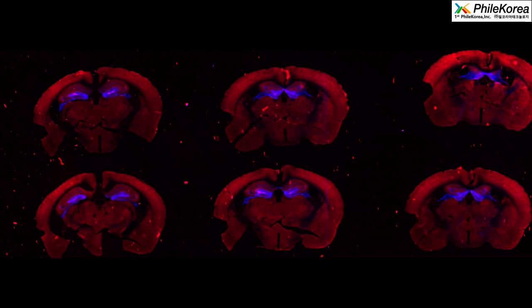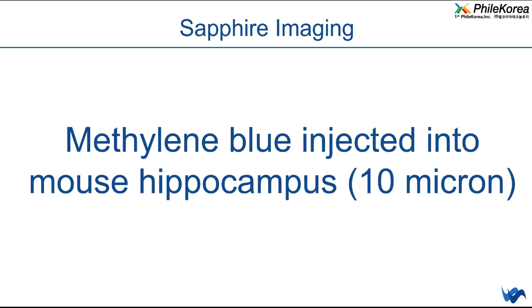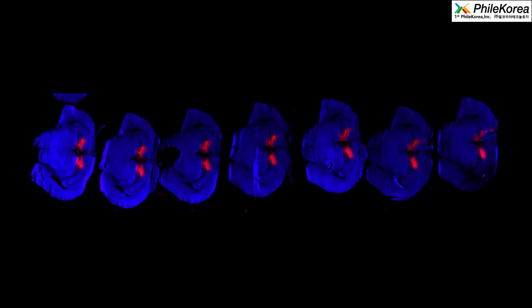And when I zoom in, you can see the hippocampus here. In green it's even better. We also used a methylene blue injection into the mouse hippocampus to localize it. This is scanned at 10 micron. And here you can see nicely the methylene blue hippocampus. It is shown in red.